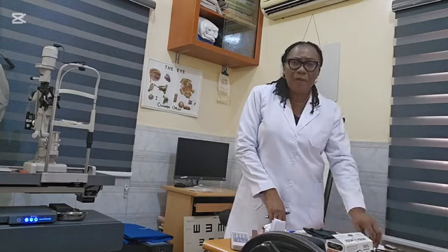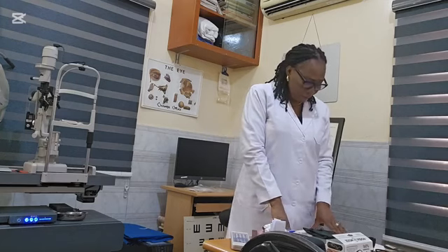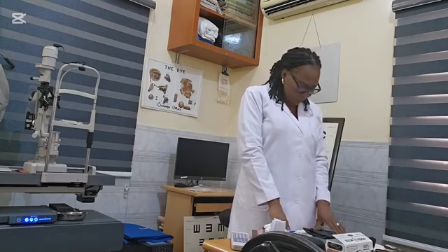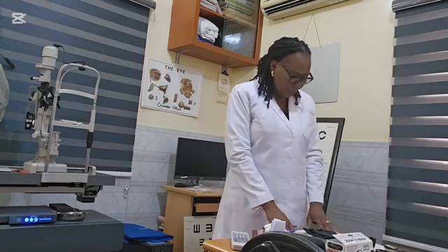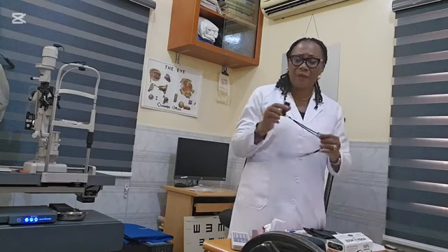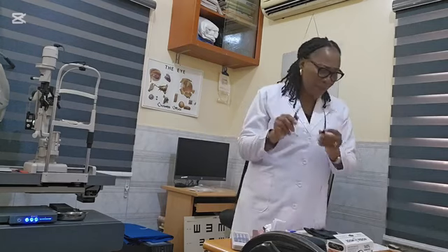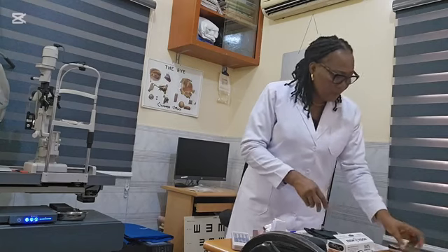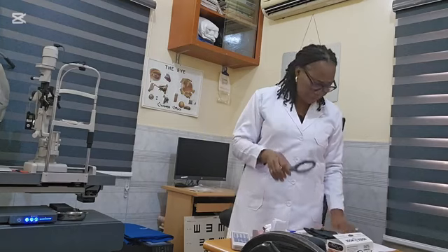So at the end of the evaluation, we've tried a 2.1x telescope. We also tried a monocular 5x telescope, and also we tried a 12 diopter handheld magnifier for reading. And my recommendation, first, is the spectacle correction for distance viewing, but that will be after a cycloplegic refraction. Then we're also going to give her a monocular telescope. She prefers this over the 2.1x TV Max Spectacle Telescope. And then for her reading, she will need this 12 diopter handheld LED magnifier for reading.